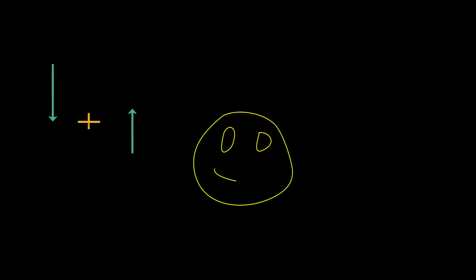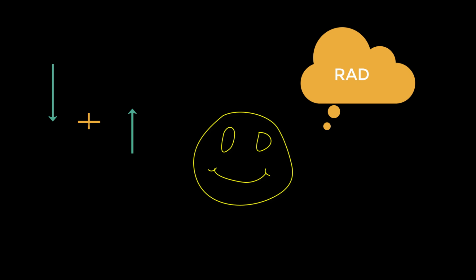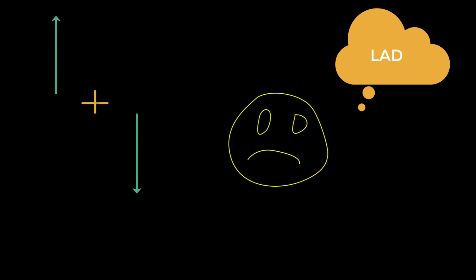One quick tip that I learned is that if you take both leads and they're pointing at each other, for example, if lead 1 is negative pointing down and AVF is positive pointing up, so they're pointing at each other, then they are, quote, right for each other, which would indicate right axis deviation. Similarly, if they're pointing away from each other, for example, lead 1 pointing positive and AVF negative, then they have left each other, and that's left axis deviation.